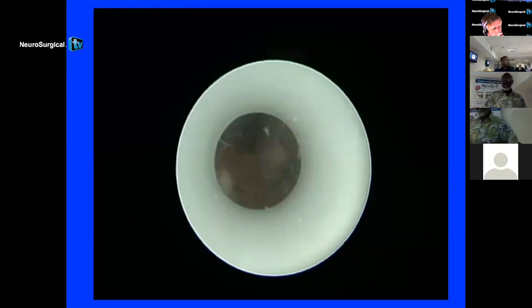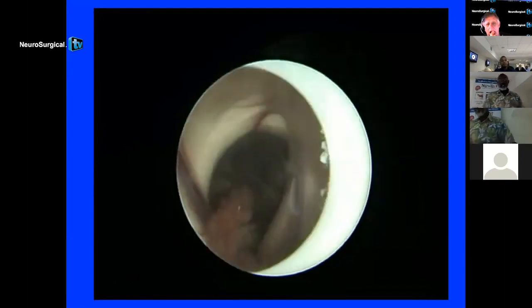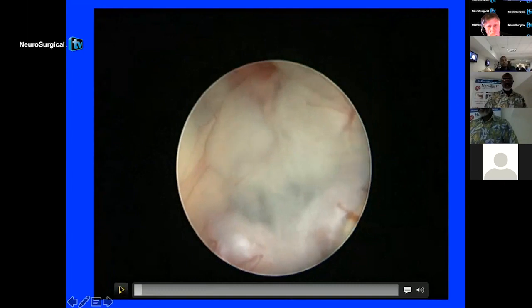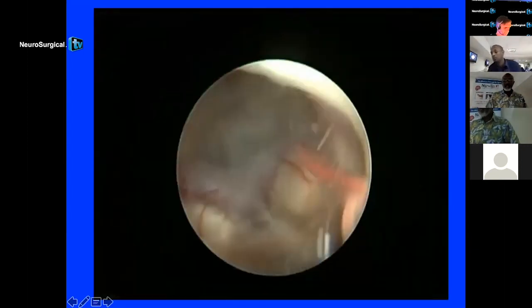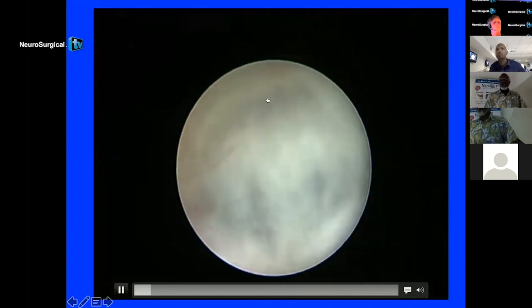What I will do now, I think you had the anatomy shown earlier on by Mahmoud Qureshi. This is an example of using the Shizuo Oi, we went through the sheath, entering the foramen of Monroe. As I told you earlier, in our setup, we sometimes have a very thick floor of the third ventricle. This one is not too bad. You can see the infundibulum of the pituitary. And that's the floor of the third. The mammillary bodies are there, widened. And in this particular case, you can actually see the pulsation of the floor of the third ventricle.